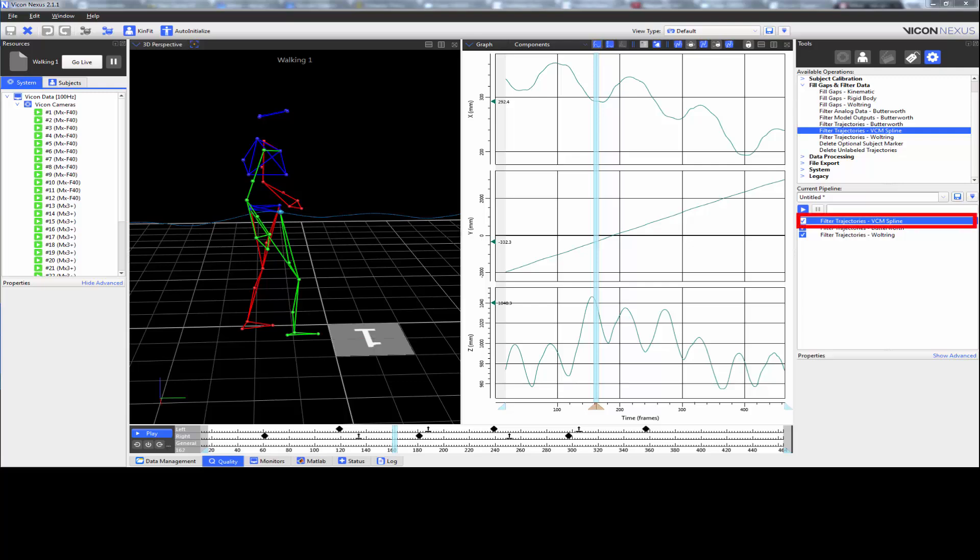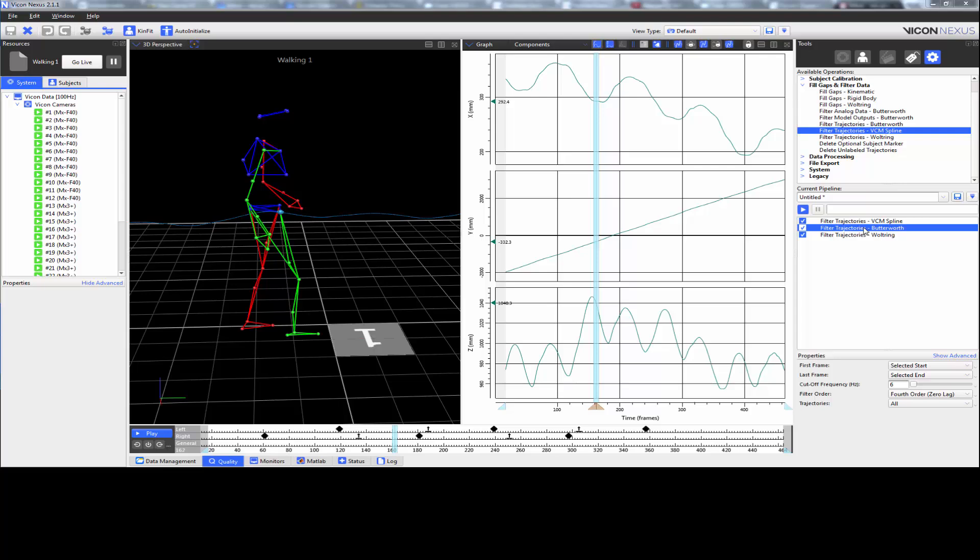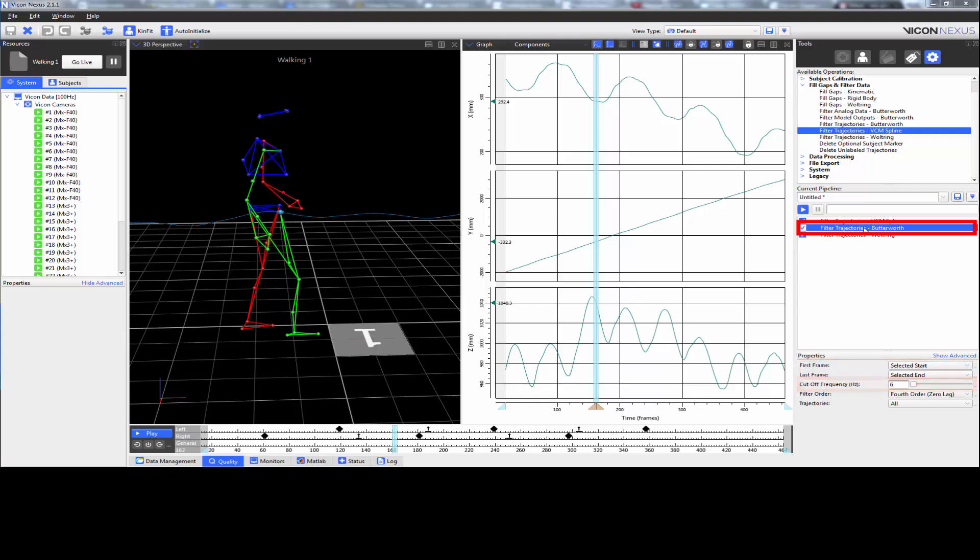The VCM filter stands for Vicon Clinical Manager and is a legacy spline. It's there if you want to use it. The Butterworth filter for trajectories has the same parameters as the Butterworth filter for analog devices, where you can select the first and the last frames, the cutoff frequency, whether it's a fourth order filter with a zero lag or a second order filter with a lag, and which trajectories you want to filter.